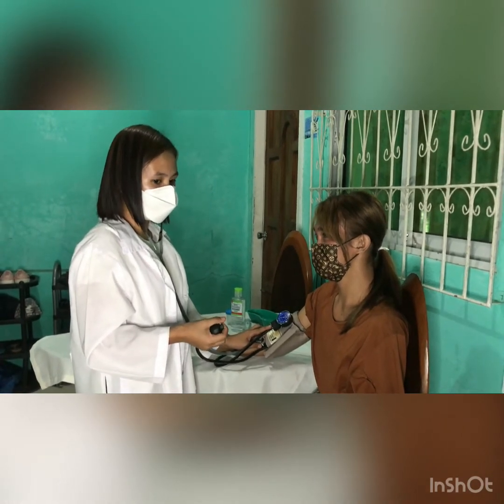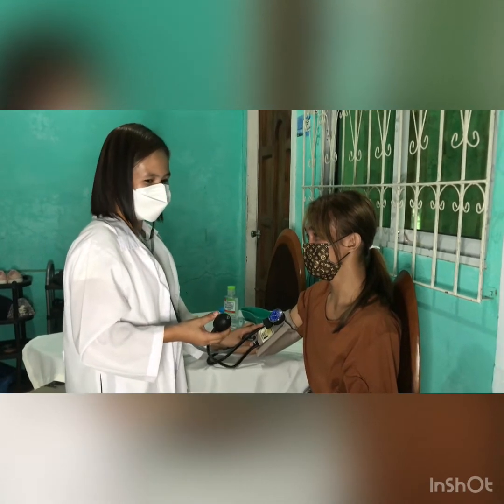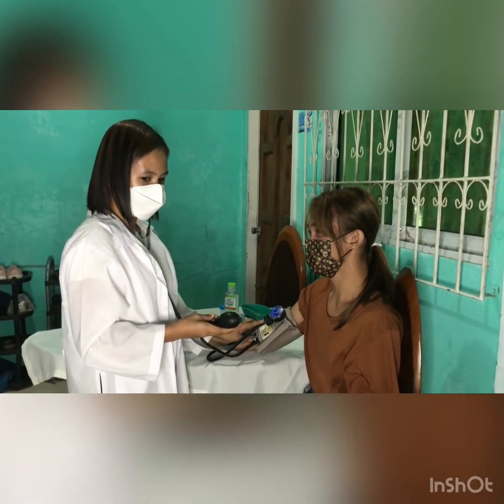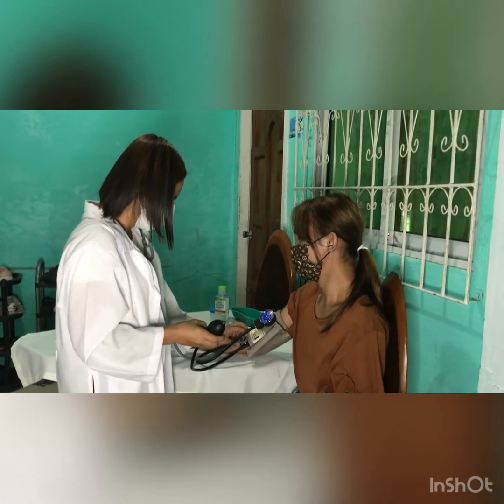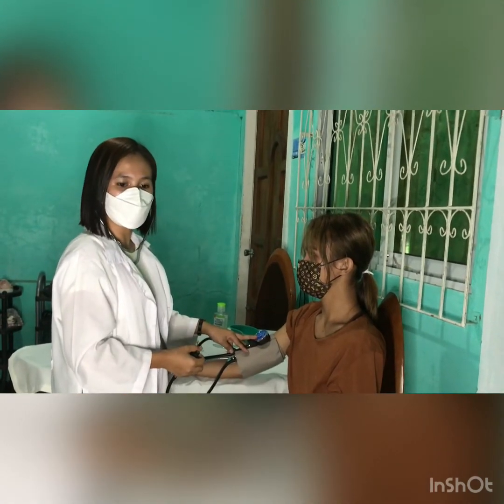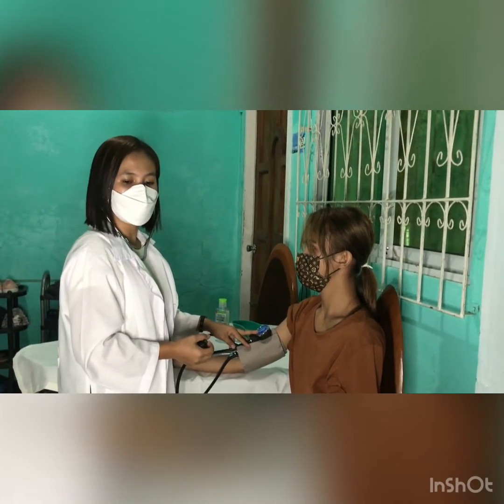Then remove the cuff from the client's arm and assist the patient to assume a comfortable position. Cover the upper arm that was previously clasped.